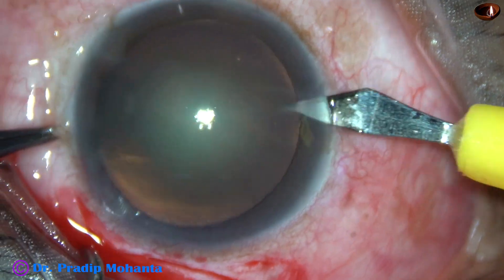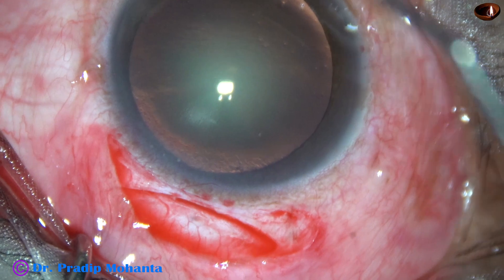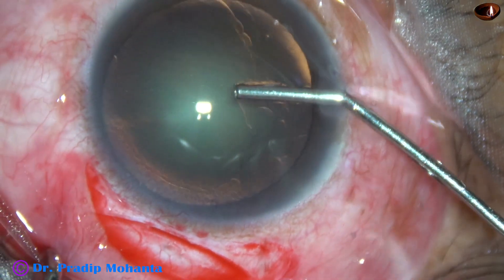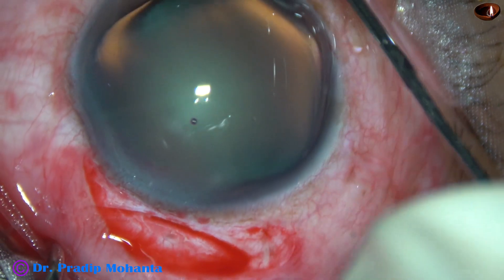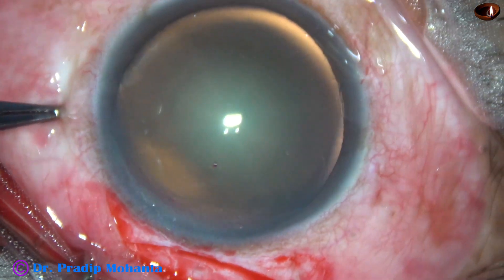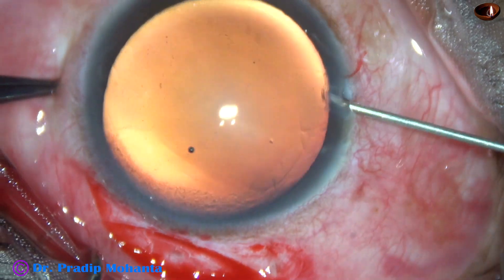A side port is made at 9 o'clock. Visco is injected into the anterior chamber and applied over the cornea, which improves visibility. We don't need trypan blue dye in this case.